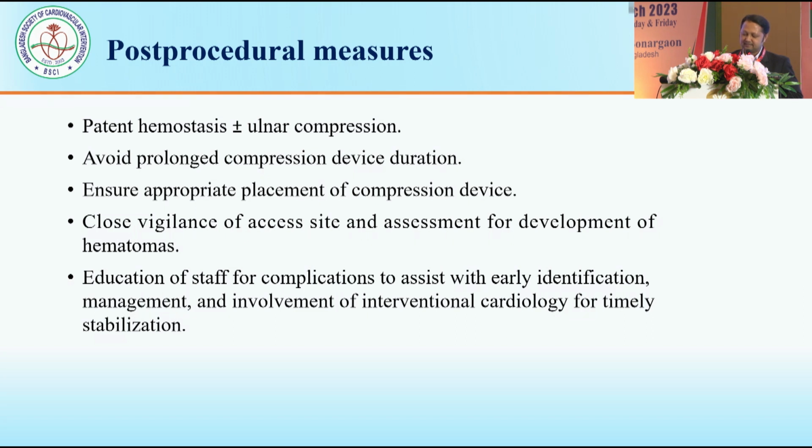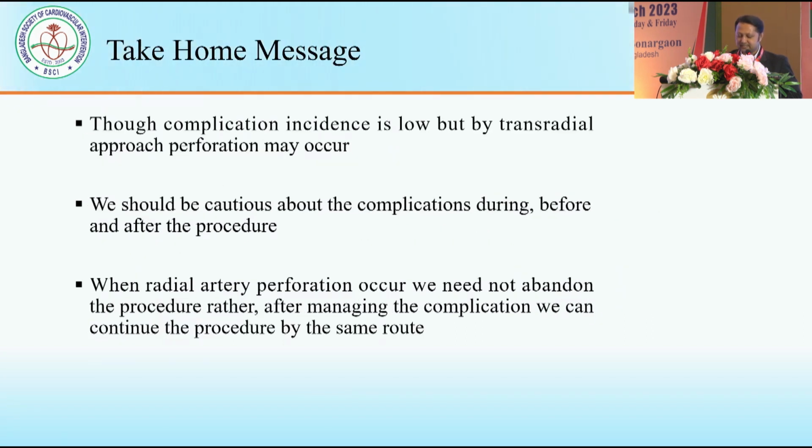Involvement of the interventional cardiologist is needed for timely stabilization. Take home message: though complication incidence is low, perforation may occur with the transradial approach. We should be cautious about complications during, before, and after the procedure. When radial artery perforation occurs, we need not abandon the procedure. Rather, after managing the complication, we can continue the procedure by the same route.